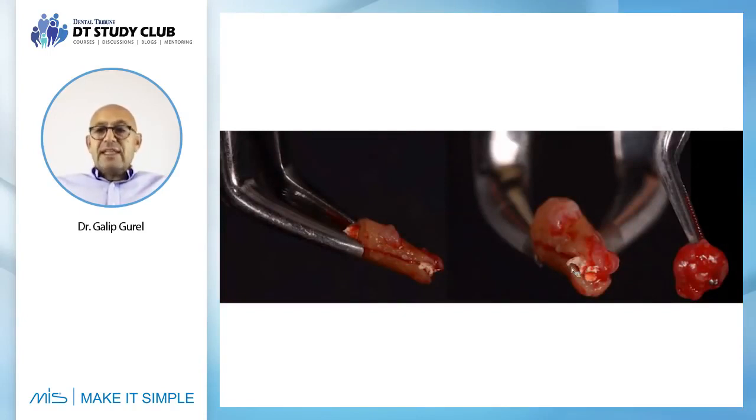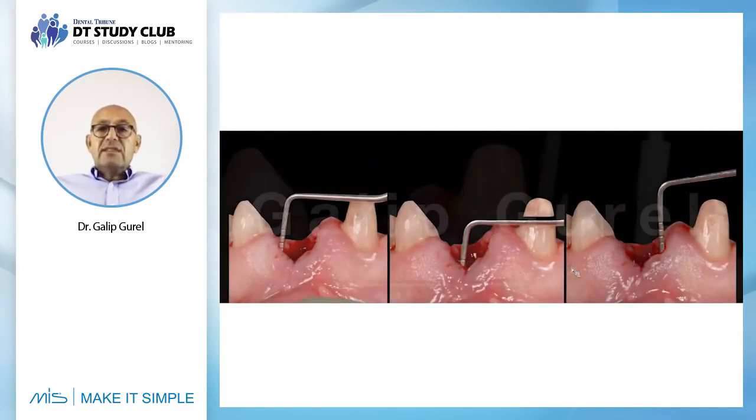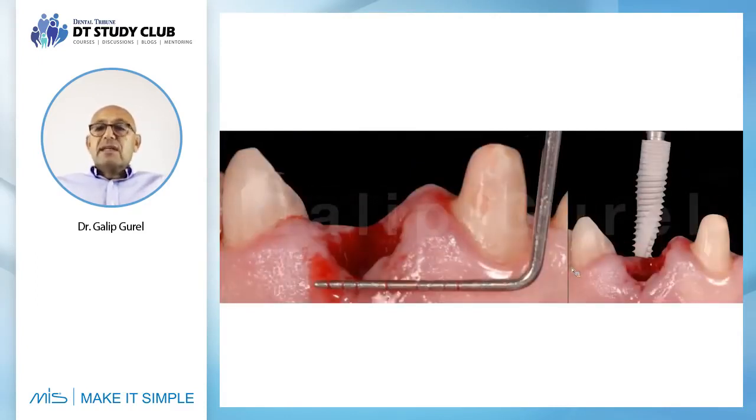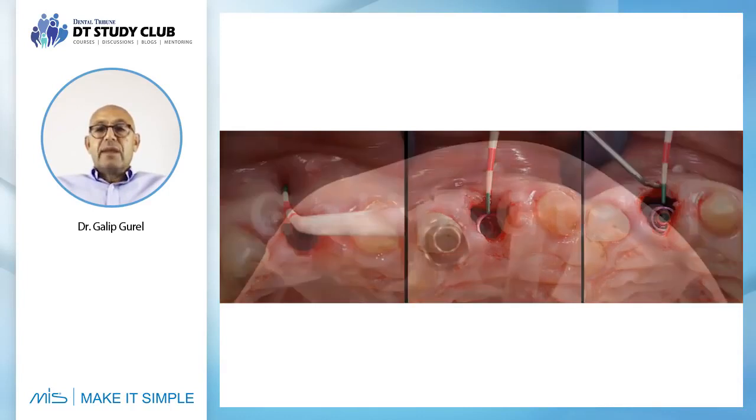This was an unsavable tooth, and then trying to find where the bone is, and simply placing our V3 into the socket. And you see the tremendous amount of area here that he needs to fill up with bone and soft tissue simultaneously.